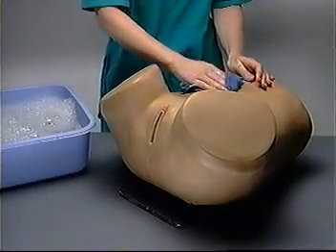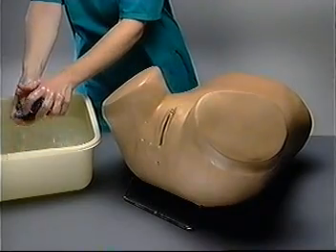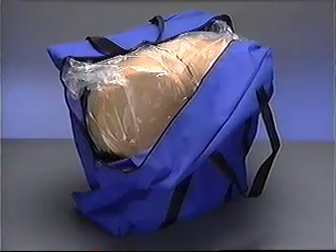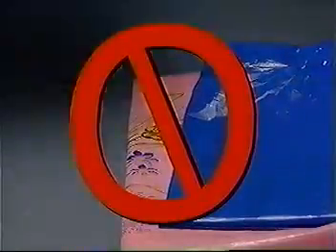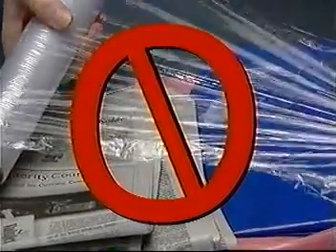Clean ZOE after every training session using a mild detergent, followed by a clean water rinse. Store ZOE in the plastic bag and blue nylon carrying case provided with your kit. Do not wrap ZOE in other plastic bags, newspaper, plastic wrap, or any other kind of material, as these may discolor the skin.